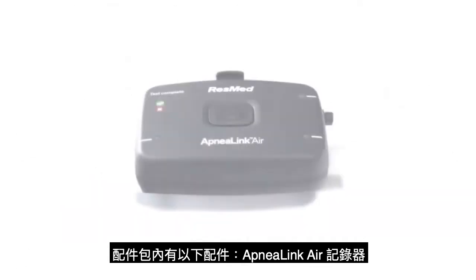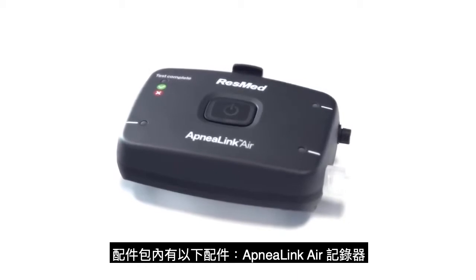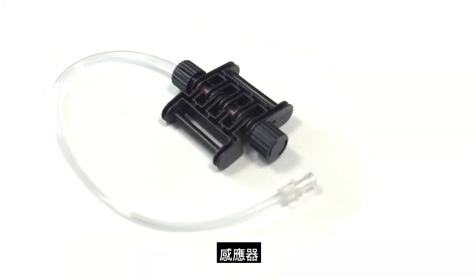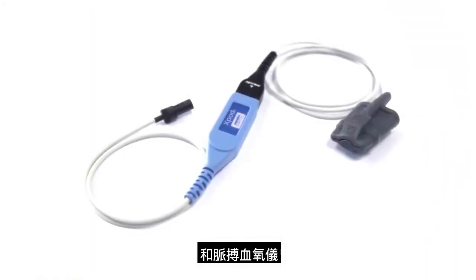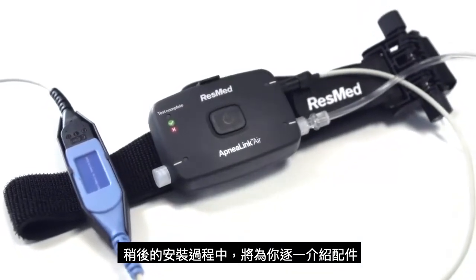When you open the pack, you find several components: the ApneaLink Air recorder, the belt, its effort sensor, the nasal cannula, and the pulse oximeter. We'll explain each of these parts as we assemble the system.